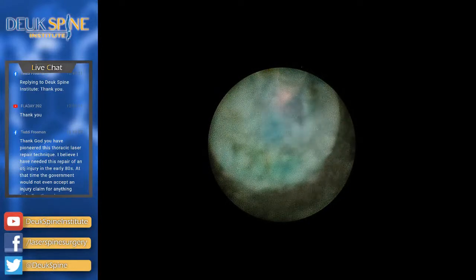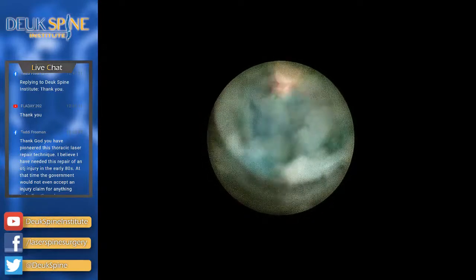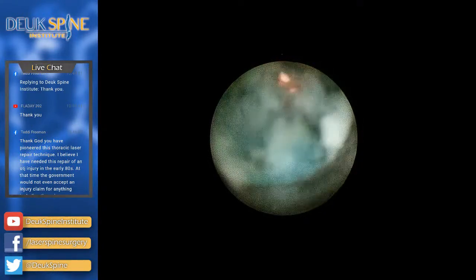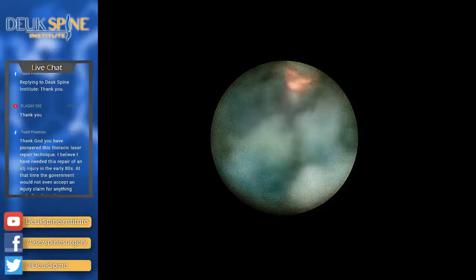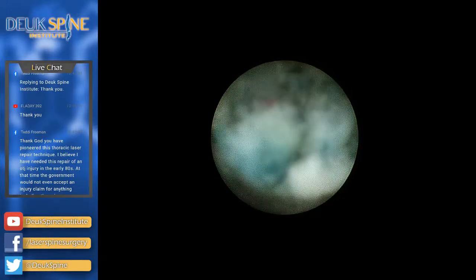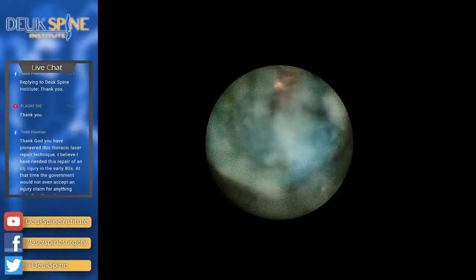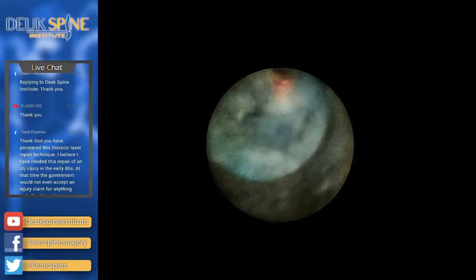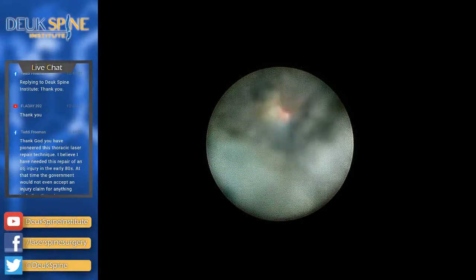We are inside the T11-12 disc, really inside the herniation, once again. And I'm debulking it right now, debulking it. That's what I'm doing. We debulk tumors and we debulk herniations. Herniation is a type of tumor. Tumor means a mass. In pure Latin, true Latin, it means swelling, which is a mass. If you have a pimple, and it's swollen and angry, it is tumor, swelling, mass.